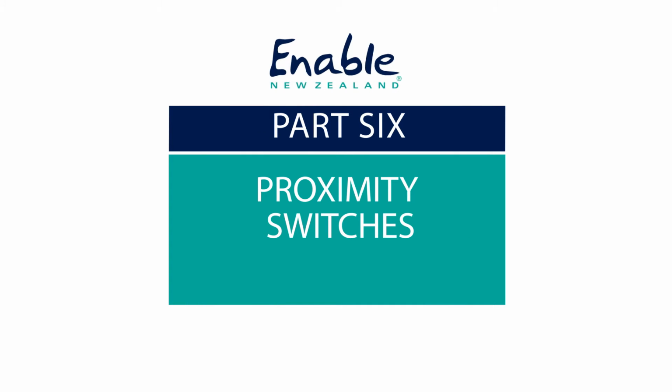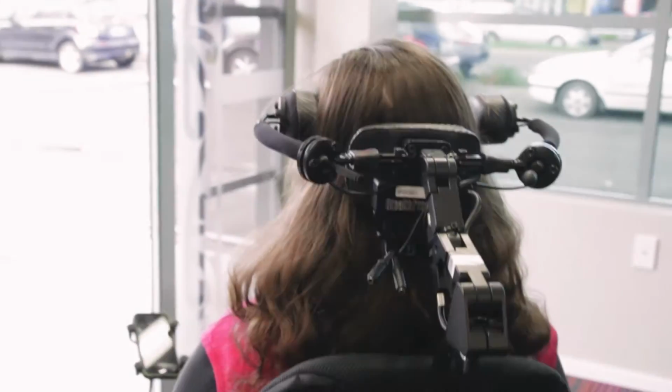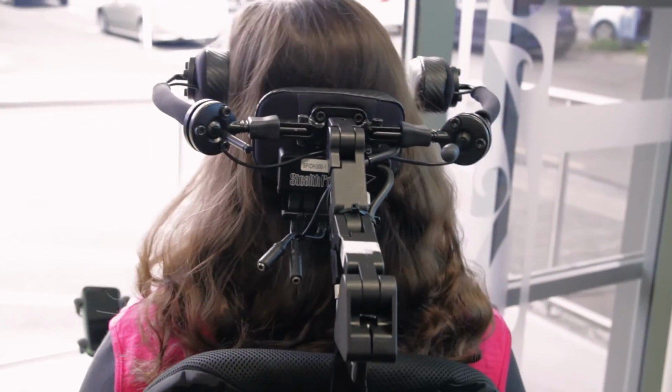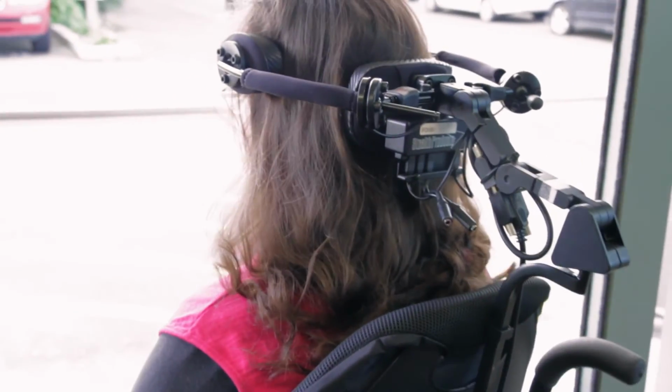Sip and puff is actually a type of mechanical switch, although for driving it does come with its own program versus some of the other ones. This compares to proximity switches, which are capacitive switches, which commonly are in head arrays. So basically it's like a mushroom of, what would you call it, Steve?